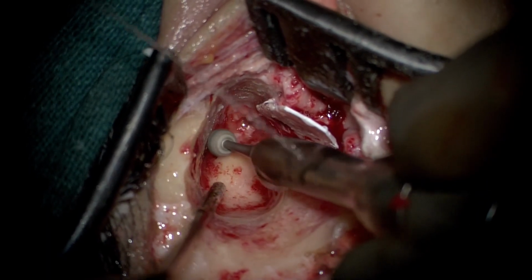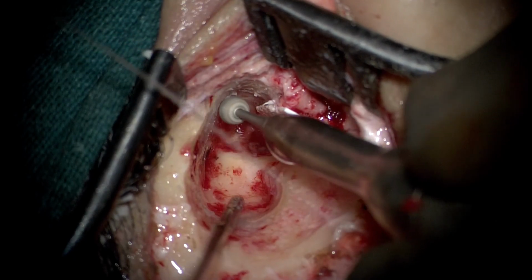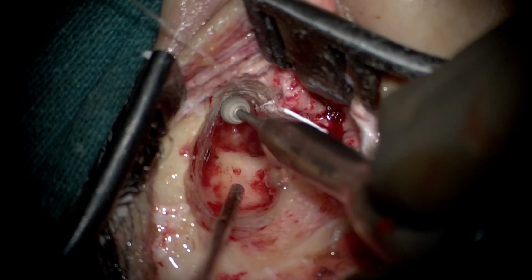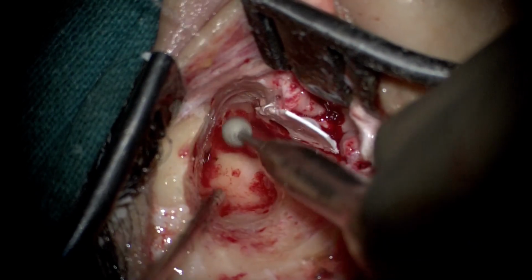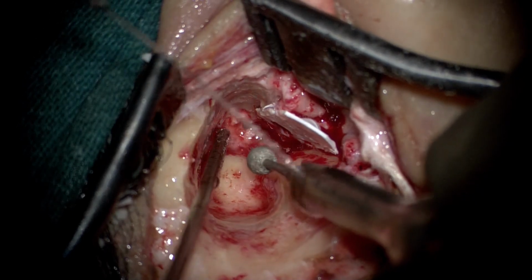As we come under a lower magnification, we can see how the mastoid cavity looks. It's a fairly small cavity. It's not a big cavity, with the ridge lowered adequately. And some of this posterior part of the cavity we will obliterate, either using cartilage or the periosteal flaps, so that the final cavity is even smaller.